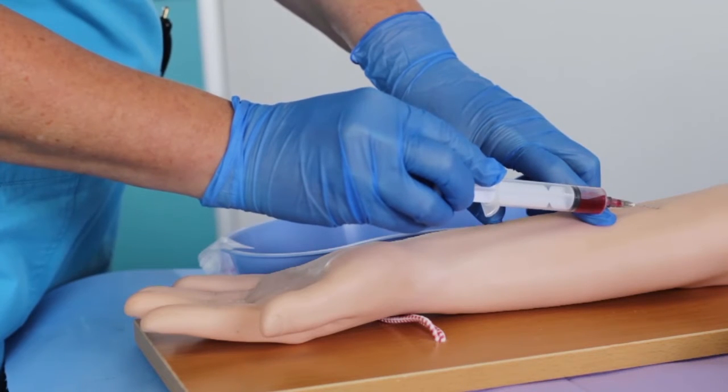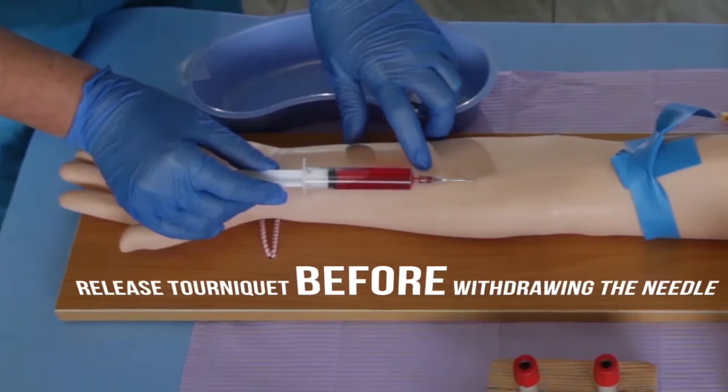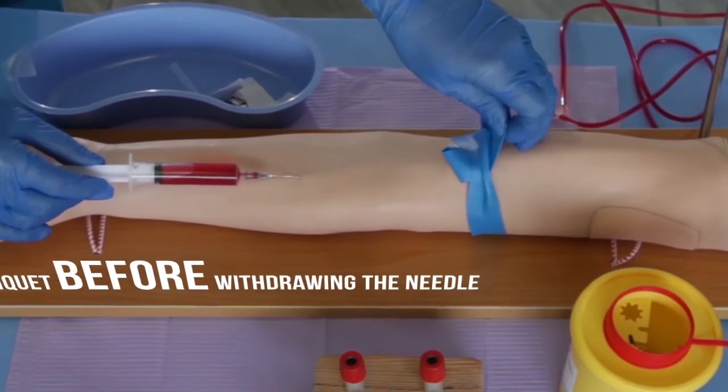Once sufficient blood has been collected, ask the patient to relax the fist and then release the tourniquet before withdrawing the needle.